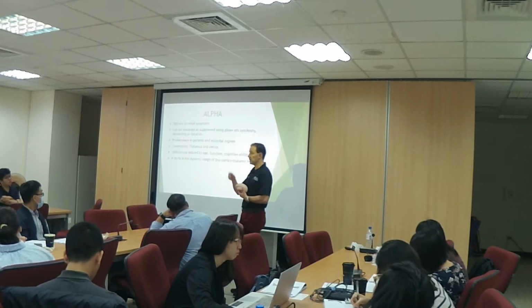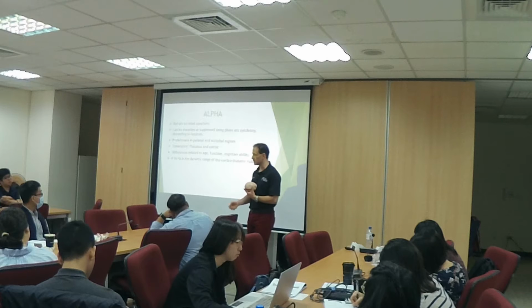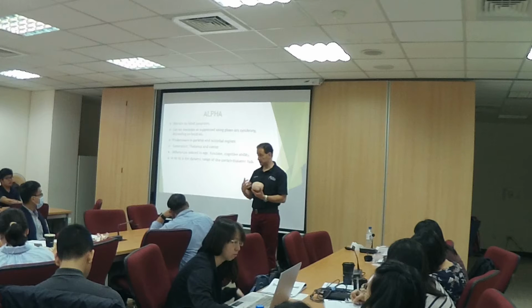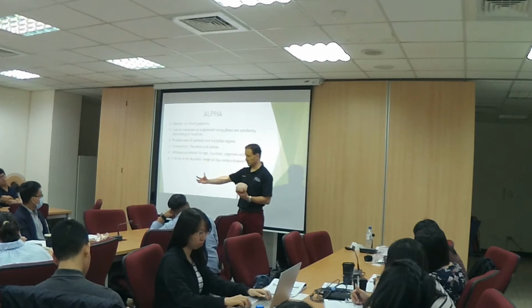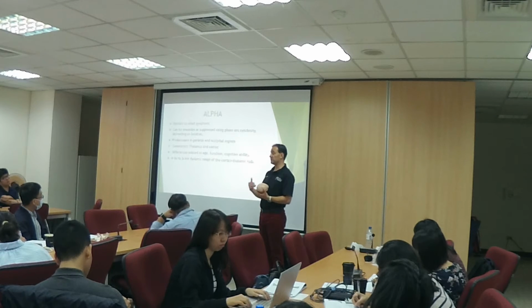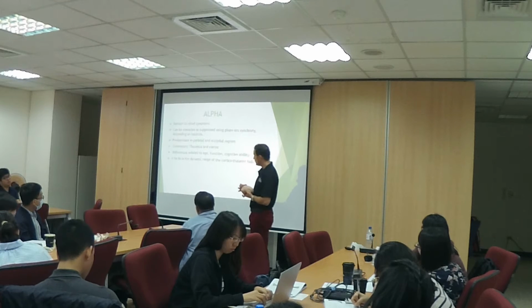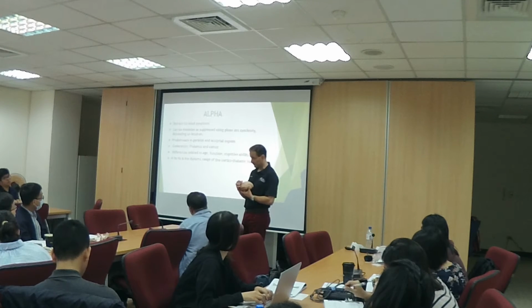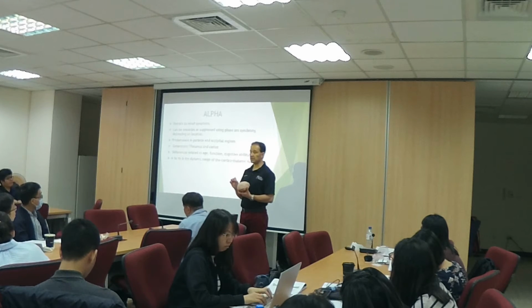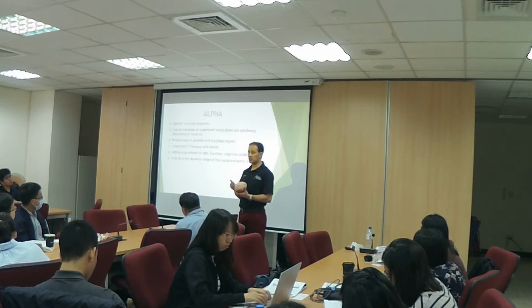Which means you tell that person, I want you to stress out. And they go, no problem. But if you tell them to relax, they go, oh, wait a second, what is that? How do you do that? Okay? So it's the person who has learned to stress out, has learned to be anxious, but they cannot relax. Even if their lives depend on it. So, very important. Now, the other important one is the peak alpha frequency. Okay, the PAF, or peak alpha frequency, which is an indicator of brain processing speed, and is an indicator of intelligence.